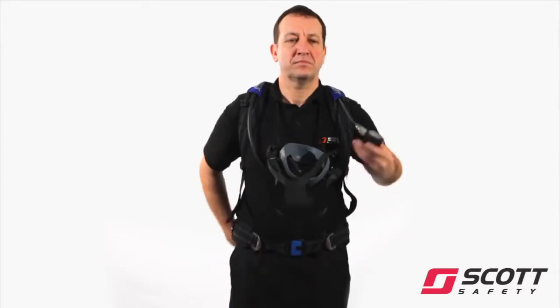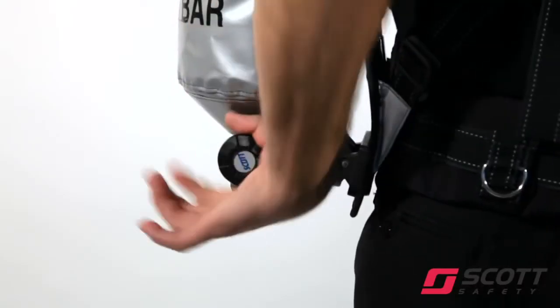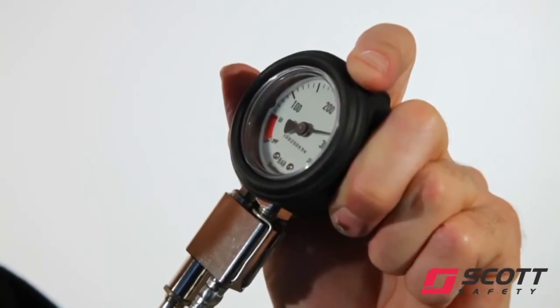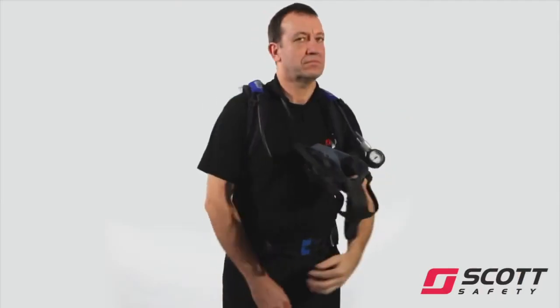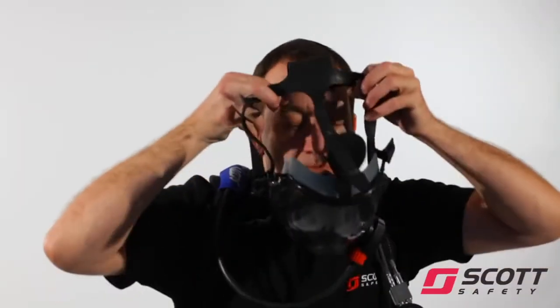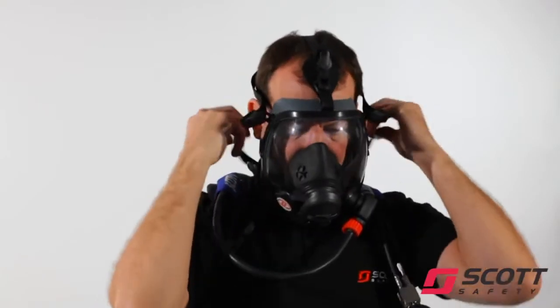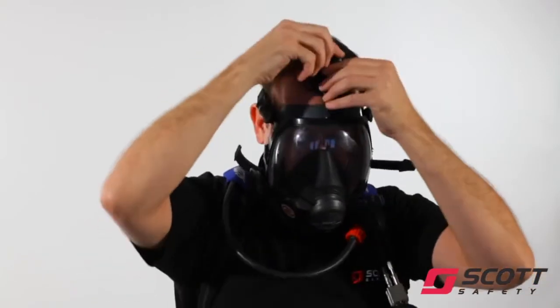Slowly open the cylinder valve and check the pressure gauge to ensure that the cylinder is at least 80% full. Hold the head harness lower straps and place chin in the chin cup. Pull the mask harness straps over the back of the head, ensuring that straps are not twisted and no hair is trapped under the face seal.